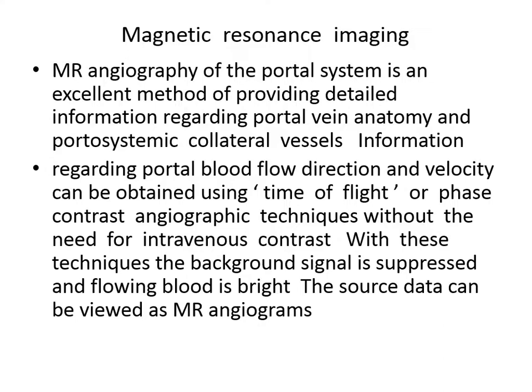How do we know the direction of blood flow by ultrasound? By color. Normally, what is the color of the portal vein? It's according to the direction of the probe. Good. Toward the probe should be red, away from the probe blue, in a standard map. The portal vein is usually towards the probe because it is bringing blood, so it should be red if your probe is in a proper direction.